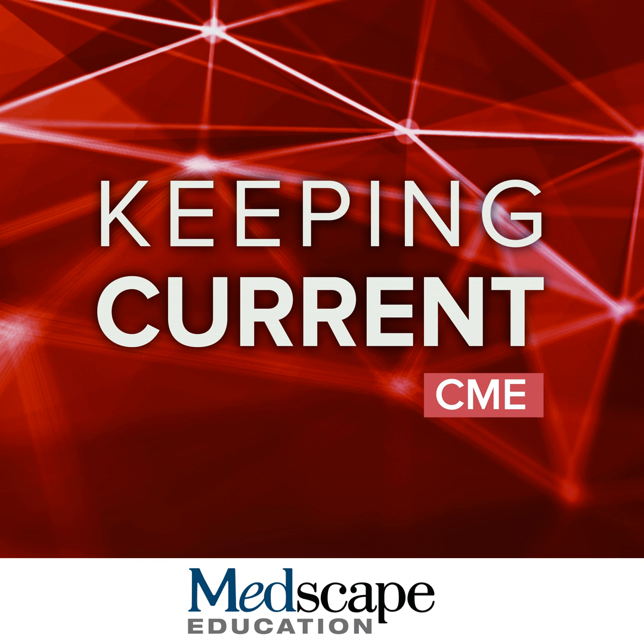I think where gadolinium comes into play is, again, if the patient is symptomatic, and particularly if they have imaging findings or clinical symptoms that don't fit for ARIA. So those where either the clinical presentation and imaging findings are discordant, or if there is a case where at initial exam on a MR brain without, it looks like ARIA and is treated as such, but if the imaging findings do not evolve as expected, then an exam for further evaluation with gadolinium may be warranted.